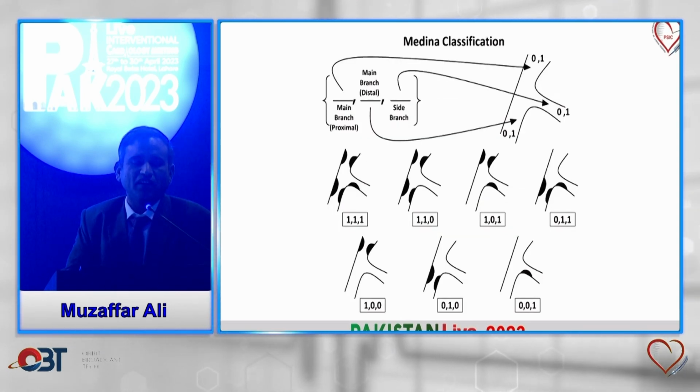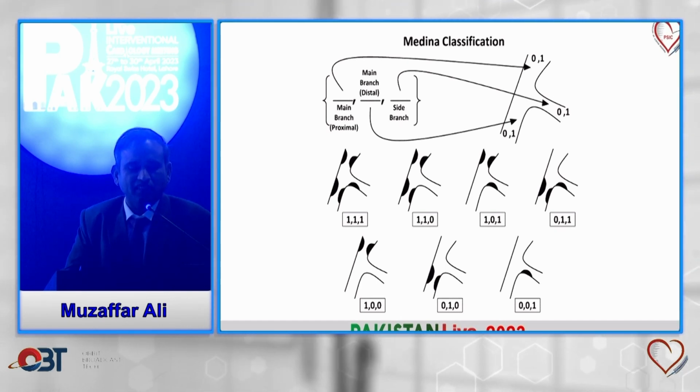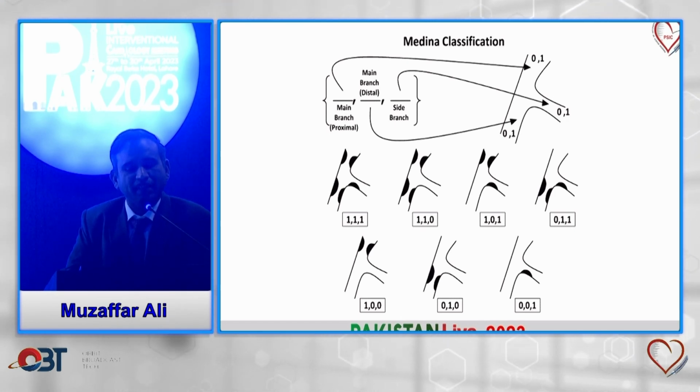Medina classification, you all are aware, when proximal and distal vessel and the side branch are involved, and it is complex when the lesion is extended into the side branch beyond 10 millimeter.